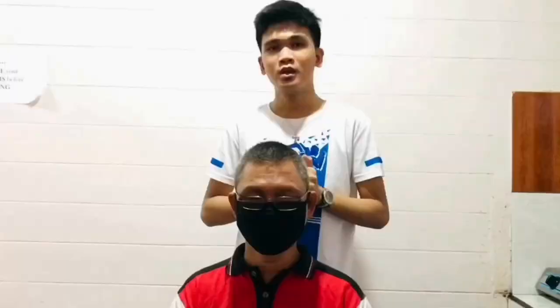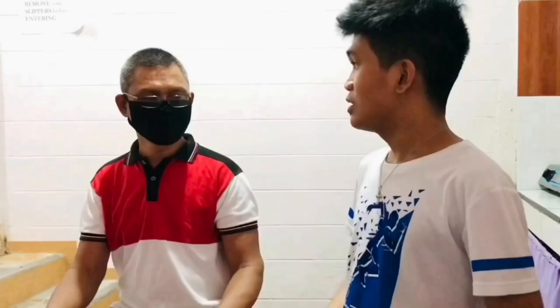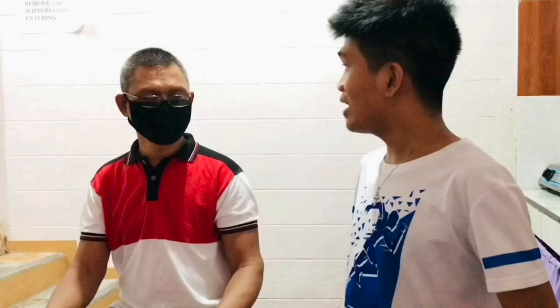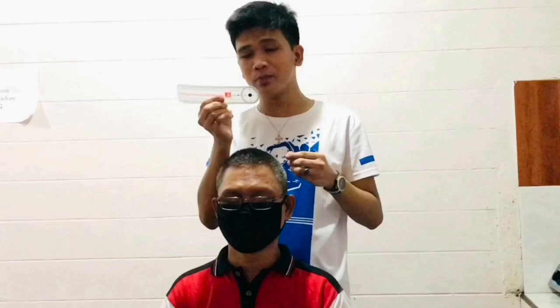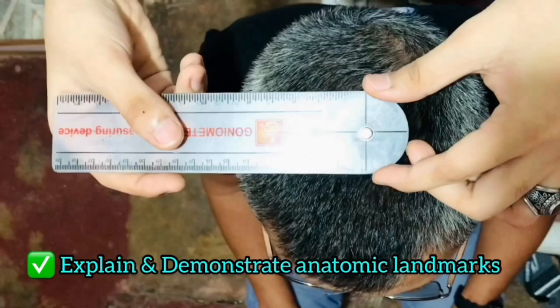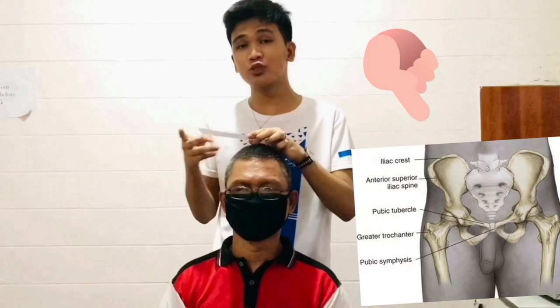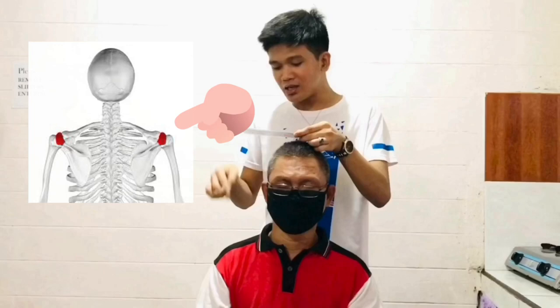First is thoracolumbar rotation. Our patient is sitting with feet on the floor to help stabilize the pelvis, and we need to use a chair without back support so that the spine can rotate freely. You have to keep your body relaxed but straight, then turn your body to one side as far as possible, keeping your feet flat on the floor. We will be using a goniometer — center the fulcrum over the cranial aspect of the patient's head. Align the stationary arm parallel to the imaginary line between the two prominent tubercles of the iliac crest, and align the movable arm with the imaginary line between the two acromial processes — the highest point of the shoulder.